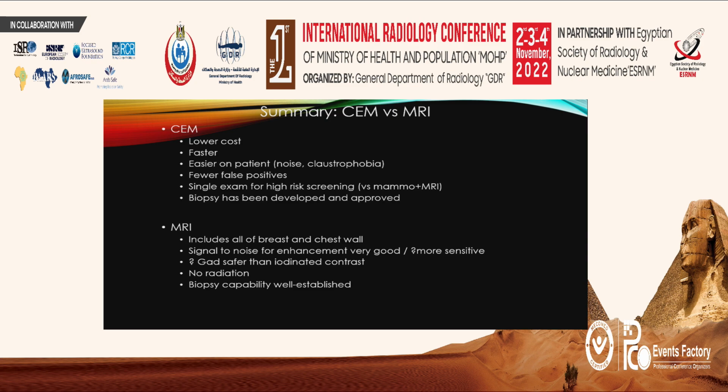MRI, on the other hand, includes more of the chest wall and the axilla, as well as the entire breast. It is better at showing small amounts of contrast. Gadolinium may be safer than iodinated contrast. MRI has no radiation, and of course it also has biopsy.